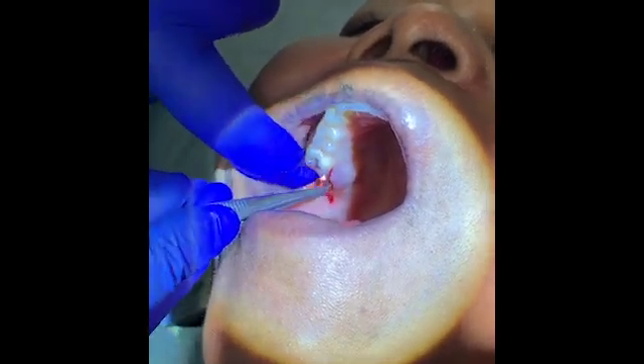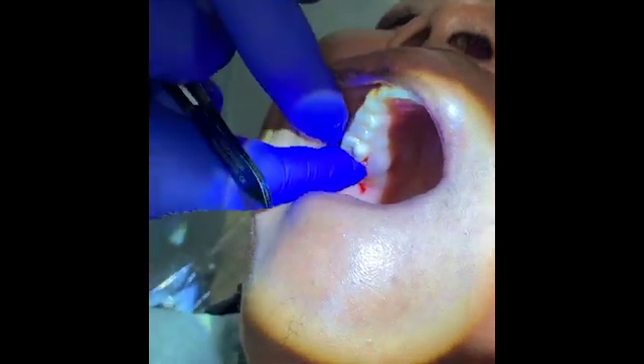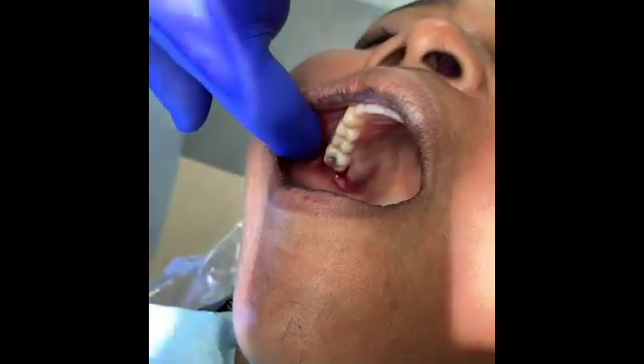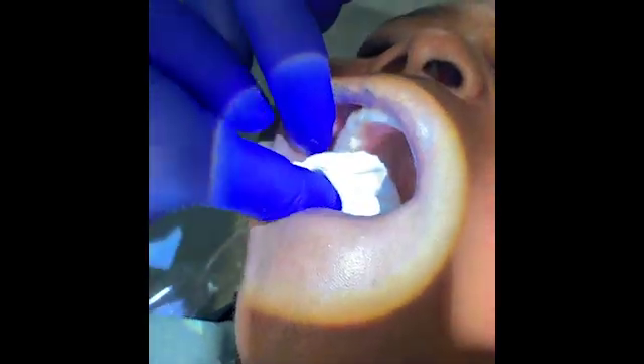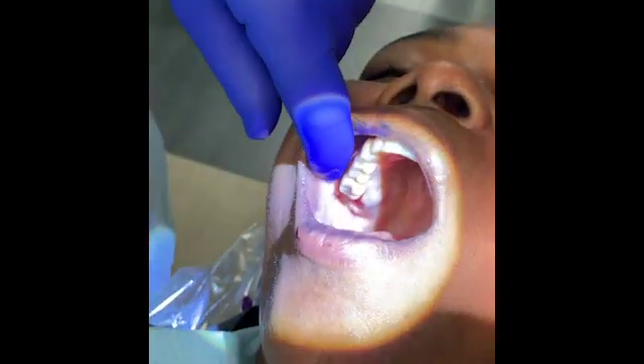See how it wants to stick, so we'll use our finger to just control that. Get our two by two — it's on the tray — and compress. And then we'll go ahead and suture that.